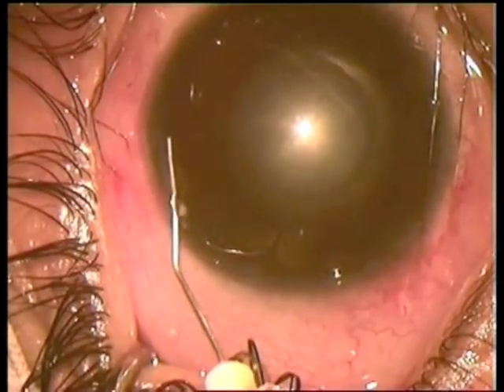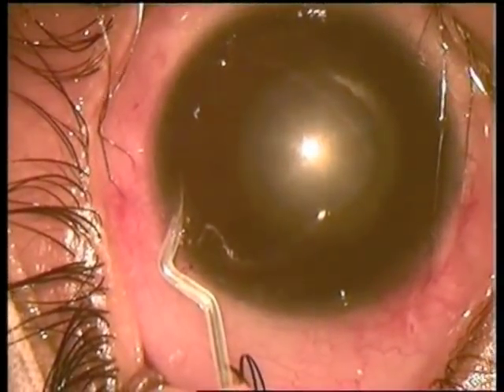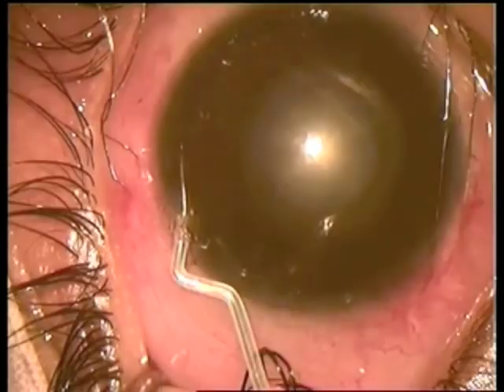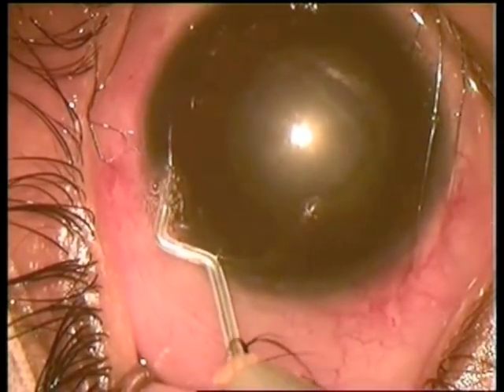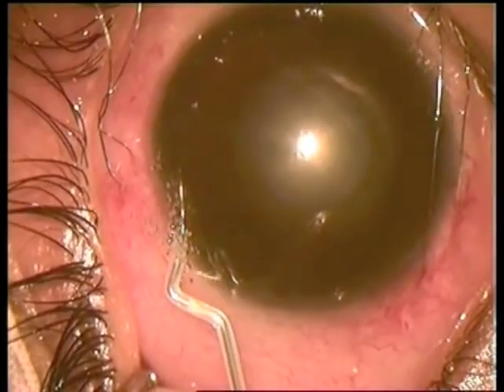There is no anterior chamber; trying to deepen it with Helon. Then we take the Fugoblade tip and perform iridotomy — one, two, three iridotomies.